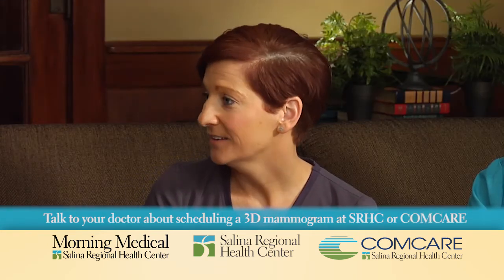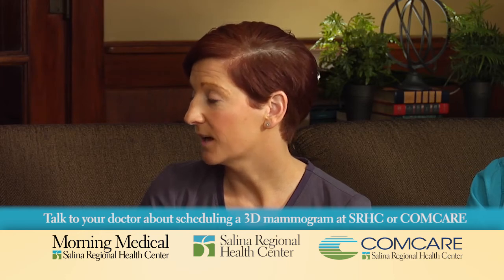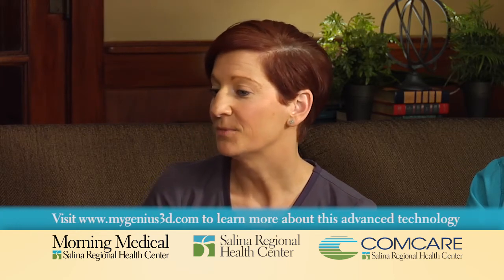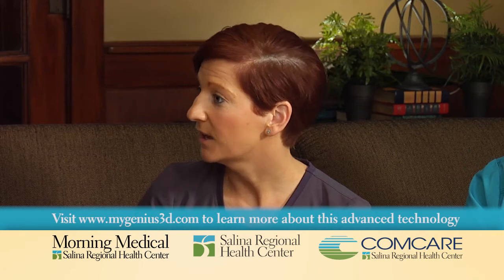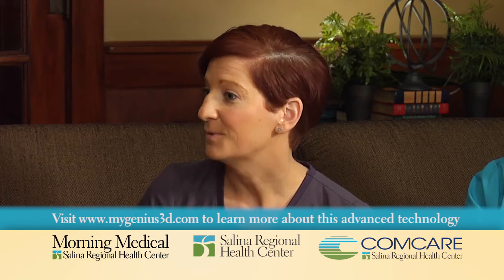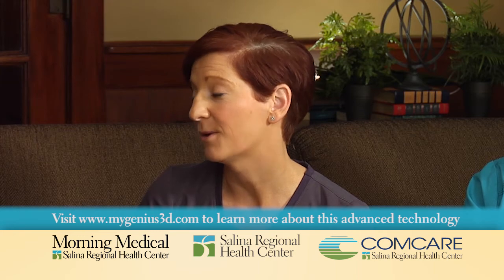So we understand that when women come in for their first mammogram, it's very uncomfortable and they're very nervous about it, as well as even the women that come in for their annual mammogram are uncomfortable about it. There's a reason why we do the compression, and it's because it reduces how much radiation you're exposed to, and it also spreads out that tissue so that if there is an underlying lesion, we can see that better. But we do our best to talk you through that procedure and hope that when you come out of the procedure, you have a more positive attitude about a mammogram.